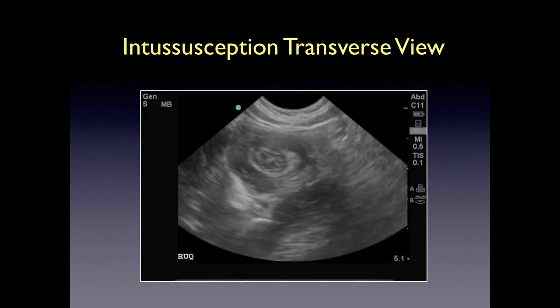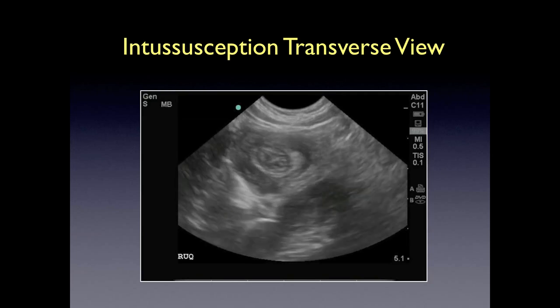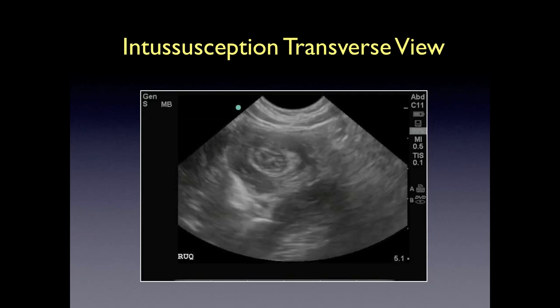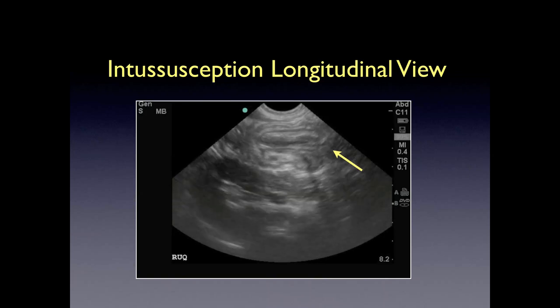This is a clip of another intussusception caught in a transverse or short axis view, as well as a longitudinal or long axis view.